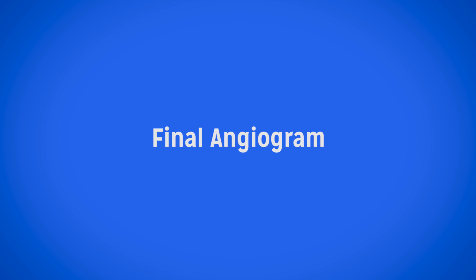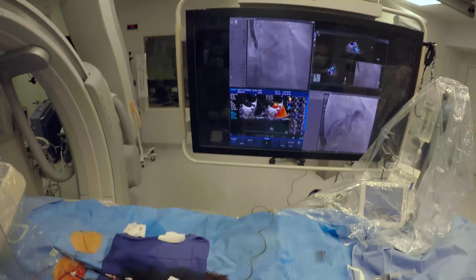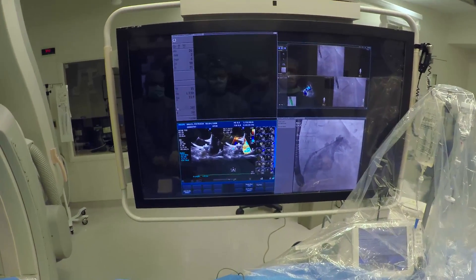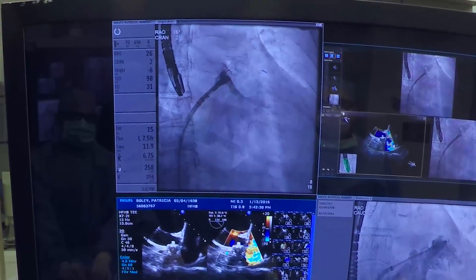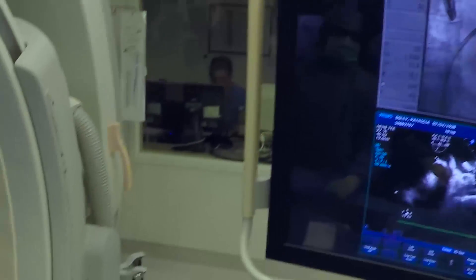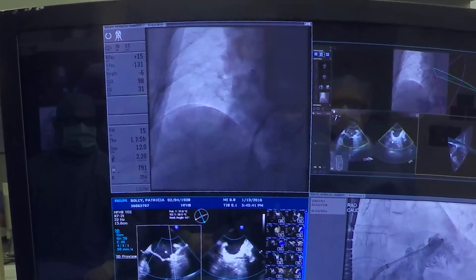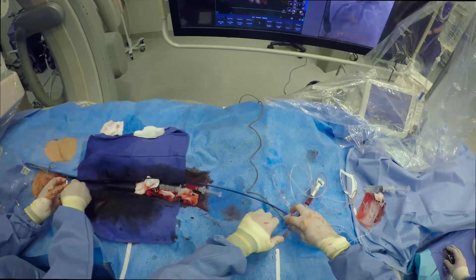The device has now been deployed and we're going to be doing a final angiogram. We have the pigtail catheter back in place and you'll see in just a moment that the device has been completely deployed. We've got the device in a very good position — the tip of the appendage has been entirely obliterated and all of the trabecula that are present that could cause clots have been removed. Then it's just a matter of removing all of the equipment and coming out to do a pre-close of the femoral vein.